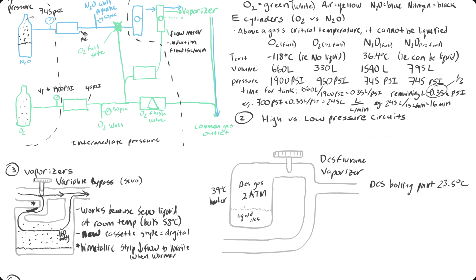It actually takes energy to go from a liquid to a gas phase. And that energy is called the latent heat of vaporization. So whenever your liquid goes to a gas, it would be cooling down this area if it wasn't for this heater. So it actually does take energy to go to the gas form, but then it's reheated immediately by this heater to hold it at this constant temperature. So it's heated to constant temp, and this avoids the cooling that happens with the heat of vaporization.